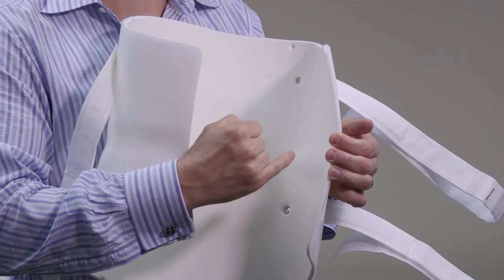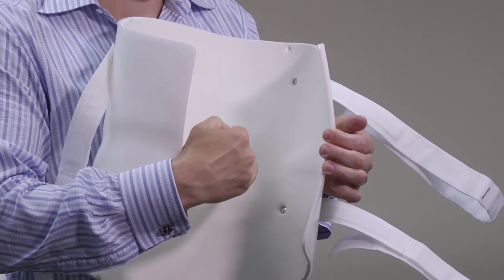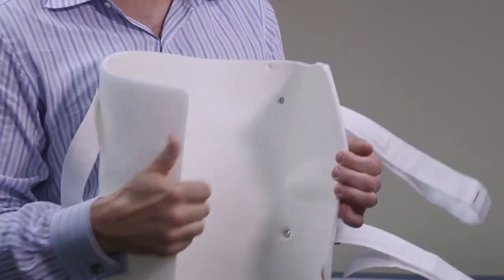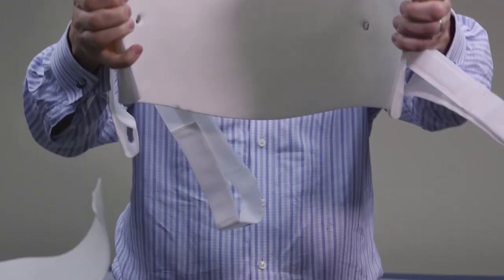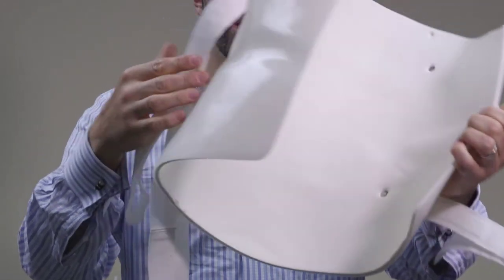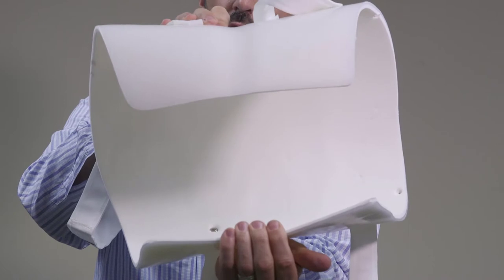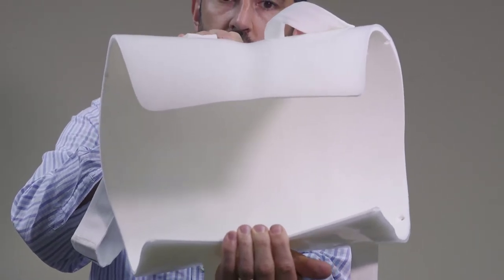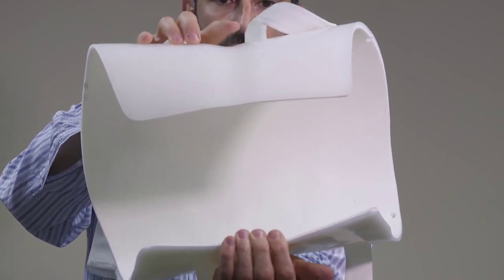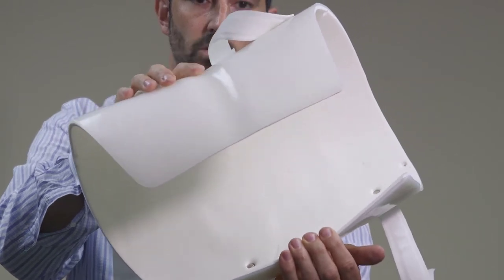Sometimes the groove is more pronounced, sometimes it's not. It partly has to do with the fabricator or the person fitting the brace. But if you can see it inside here, that's where the waist groove is — that's what we mean by the waist groove. If you look at it from the outside as well, there's a little groove right there. It's not going to be a gigantic thing that jumps out at you, but it's an important part of the brace.